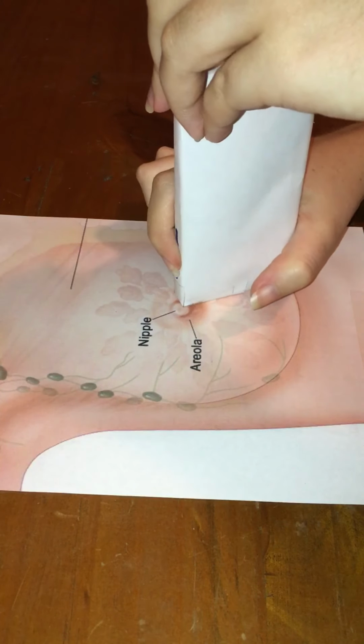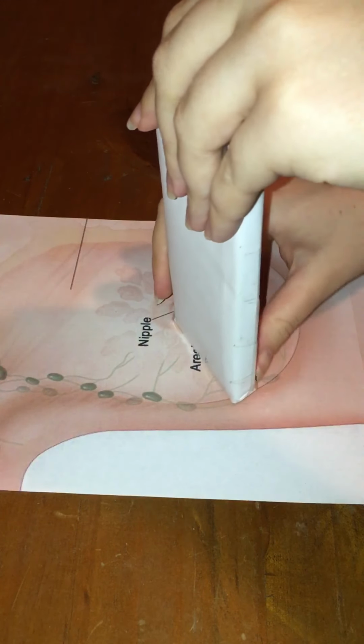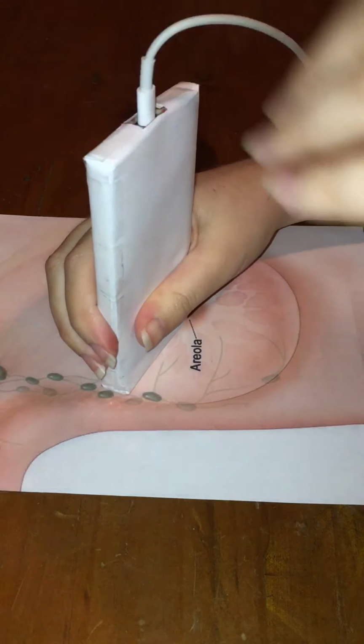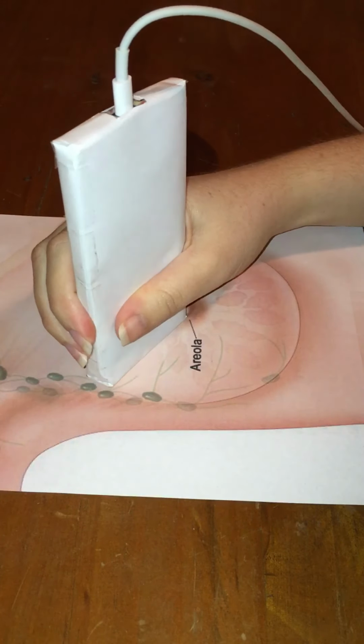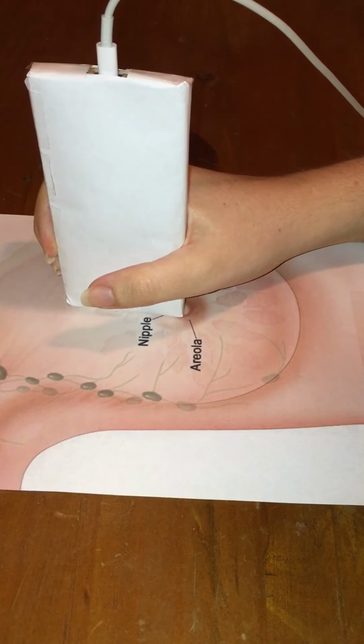As I move through the scan, I continue to change my probe grip to ensure that good ergonomics are carried out. This survey ensures the tissue surrounding the nipple is imaged.